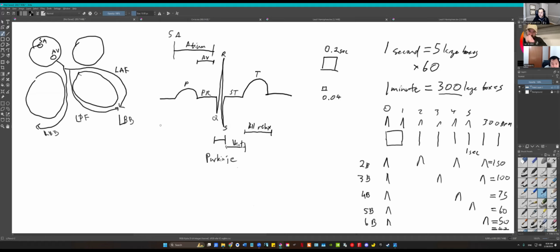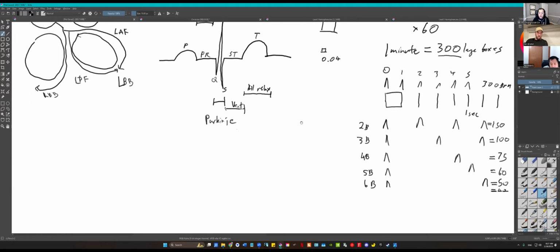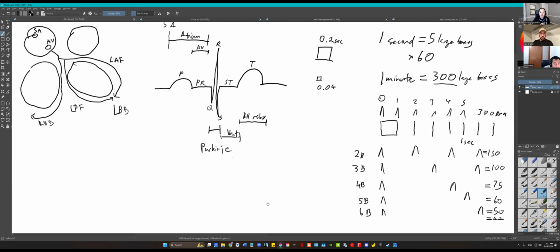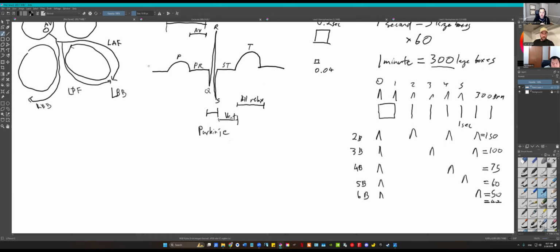Okay, all right. So kind of set that aside for a little bit. I realized I skipped something. Sorry, that's why I'm doing this trial run, right? We need to talk a little bit about numbers. We do have to memorize a few numbers, okay? So let me just move this up here. All right, so right now what we're going to focus on is this one heartbeat tracing, the P, Q, R, S, T. These are important.